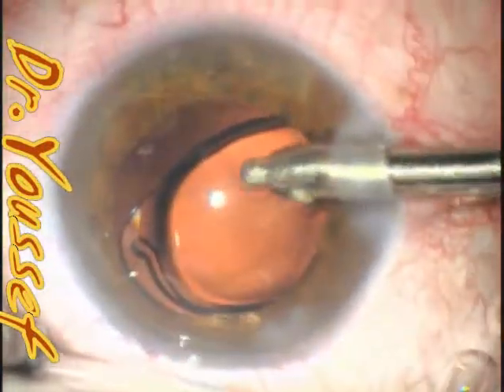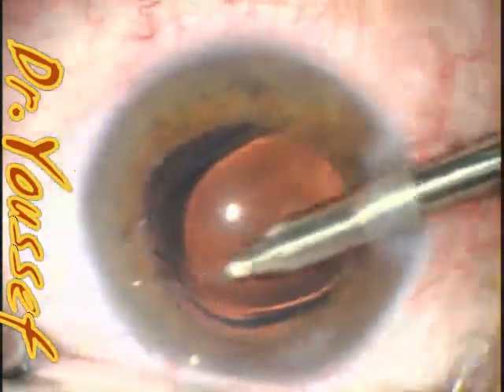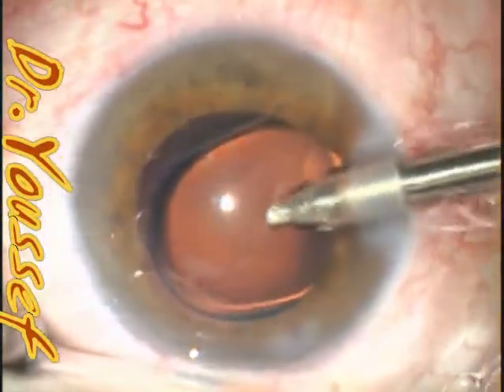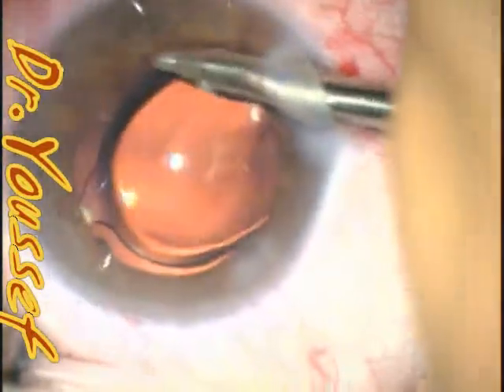And you can see here that the lens — the haptic wasn't completely open yet. And when I started the IA, it actually jumped a little bit forward. And when it relocated again, probably the haptic went into the sulcus at this stage.